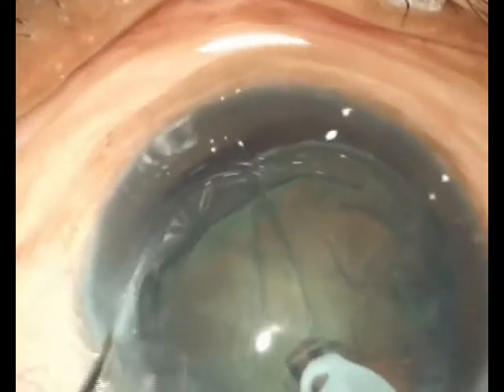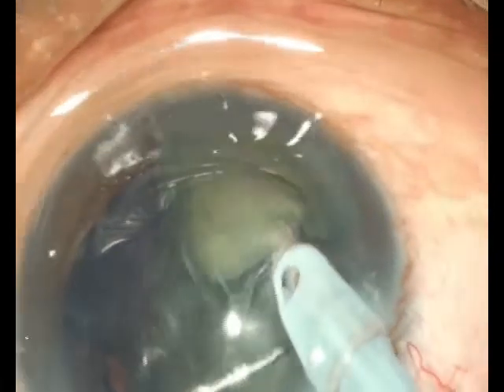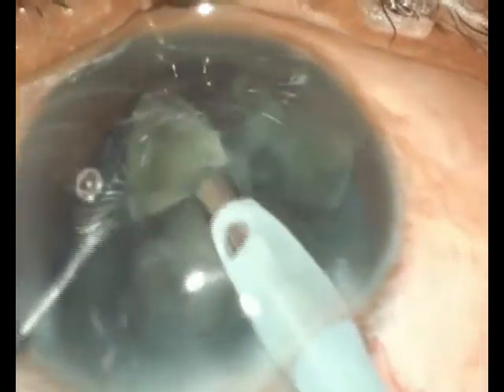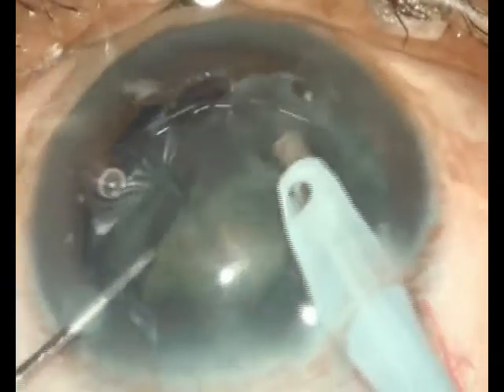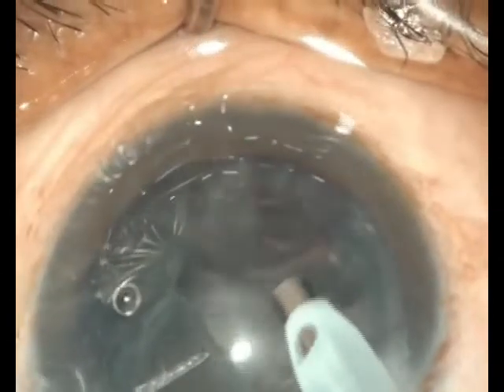Following a hydro prolapse, if there is a significant nucleus then all the surgeon needs to do is impale, hold, chop, downsize, and emulsify as demonstrated in this video. The take home message really is that whether you do a hydro prolapse and aspiration or whether you do a hydro prolapse and chop is largely dictated by the consistency of the nucleus that you are dealing with.